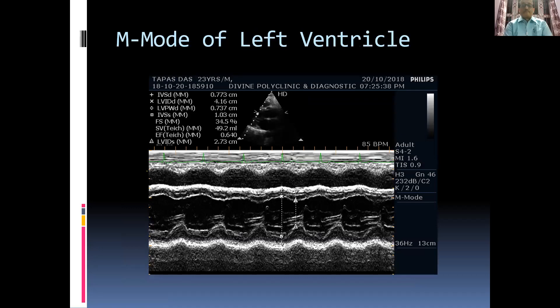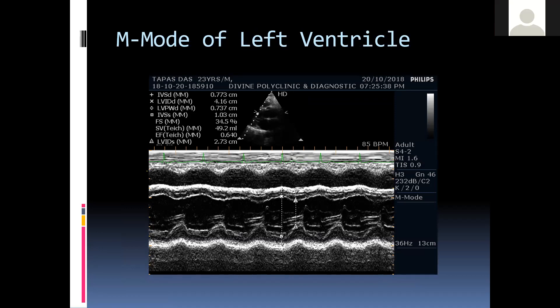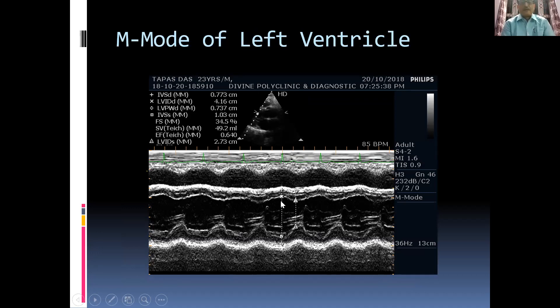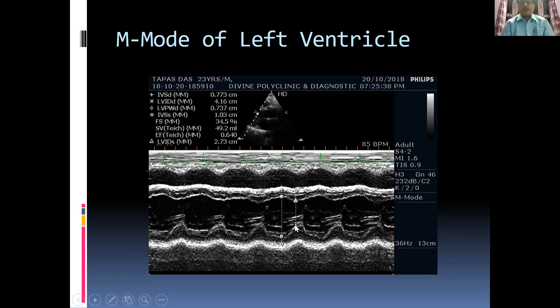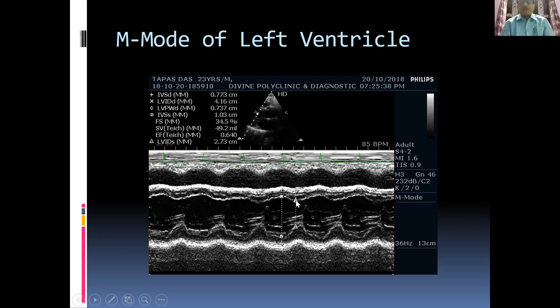The septum is measured in diastole when the LV opens to its maximum extent, from leading edge to leading edge. The posterior wall is also measured from leading edge to leading edge. The LV internal diameter in diastole is measured from here to here, and in systole from the lowermost part of the interventricular septum to the corresponding point on the LV posterior wall — not the highest point. You must drop a perpendicular from the lowest point to the corresponding point on the posterior wall.